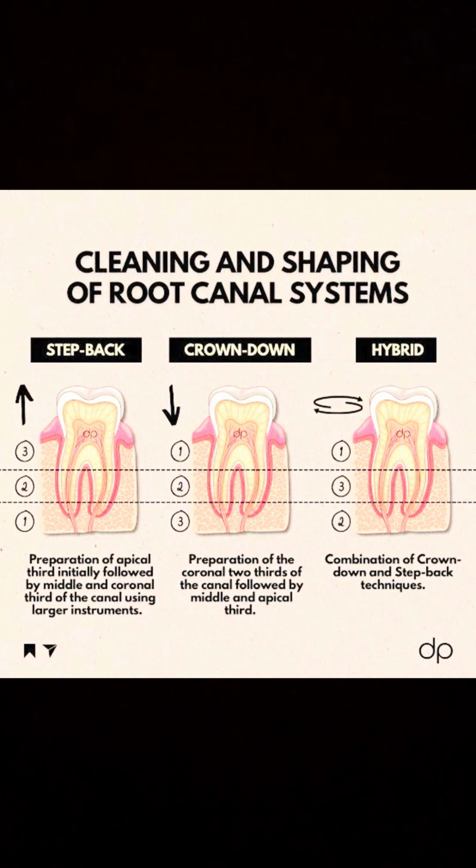The shaping process of the root canal can be broadly classified into phase 1, which is glide path determination, and phase 2, coronal pre-enlargement, which is orifice enlargement, followed by working length measurement, root canal shaping technique, and root canal working width.